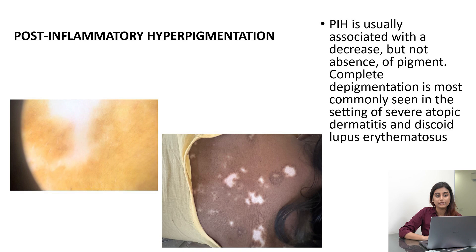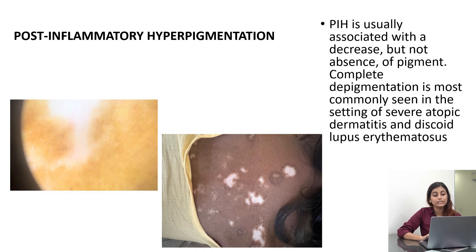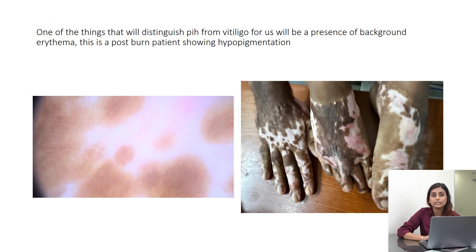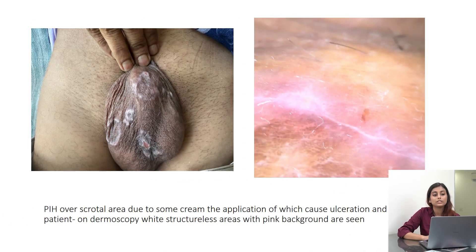Post-inflammatory hypopigmentation is associated with a decrease in pigment, not an absence of pigment. In contrast, here we see an absence of pigmentation as seen in diseases like DLE — this patient has disseminated DLE with absence of pigmentation. In PIH, one classic feature is that you won't just see decreased pigmentation; you would also see erythema, visible under a dermoscope. This post-burn patient has hypopigmented lesions; another patient applied a cream to a genital lesion which left them with ICD and post-inflammatory hypopigmentation, showing a background of erythema and white lesions.